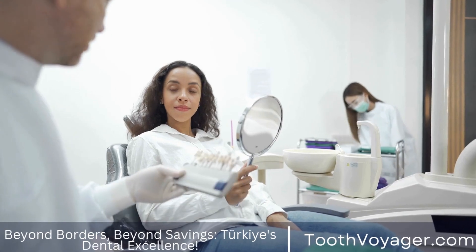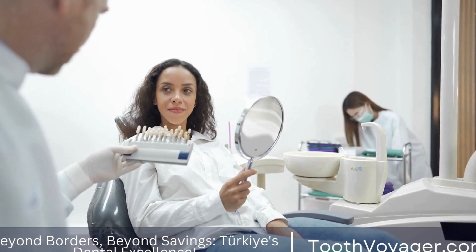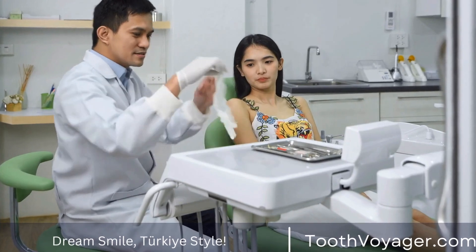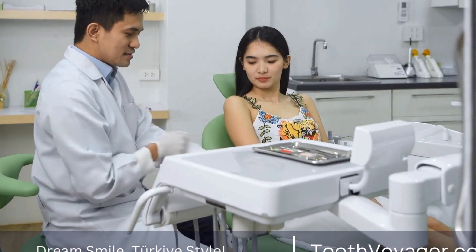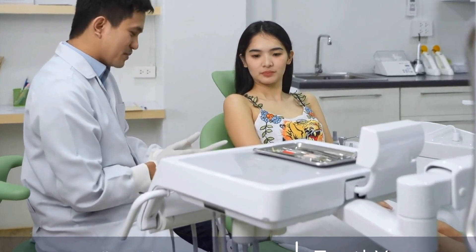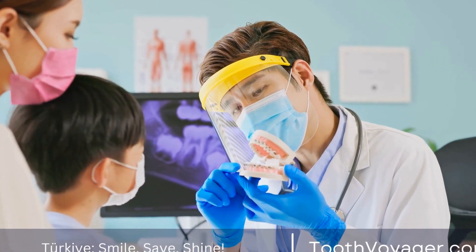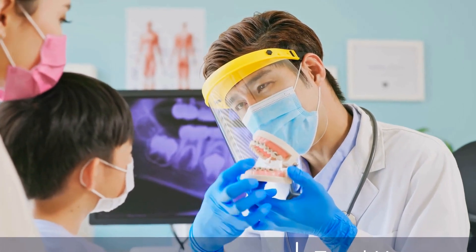After the dental prosthetics are made, the next step is to schedule the fitting appointment. In this visit, the dentist will make sure that the prosthetics are fitted within the mouth of the patient and feel comfortable. Patients will also be given guidelines regarding how to take care of the dentures as well as maintain excellent dental hygiene.